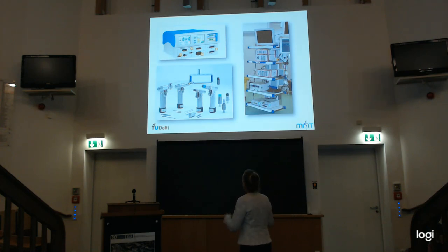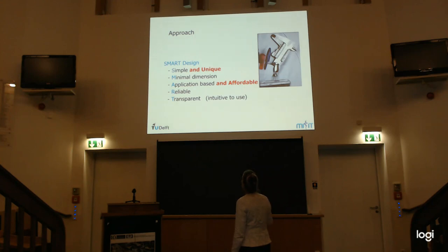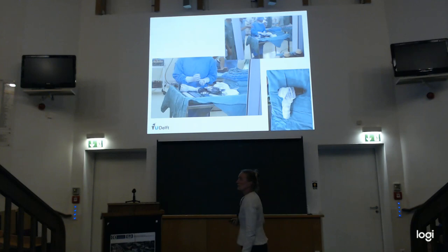Even so, we look at developing affordable solutions. For example, this is a picture where they are putting gloves around a surgical drill. They got a drill that you can buy at the local hardware market, and put a glove around it. When I saw it being done, it was really not staying up, because it was handling the whole drill and putting the gloves around it, and with the wrong grip again. That's not really clean.